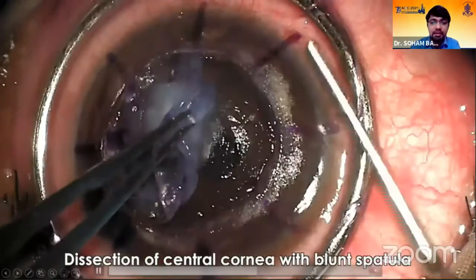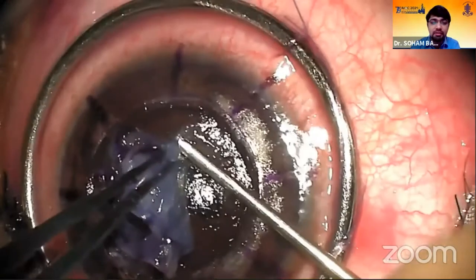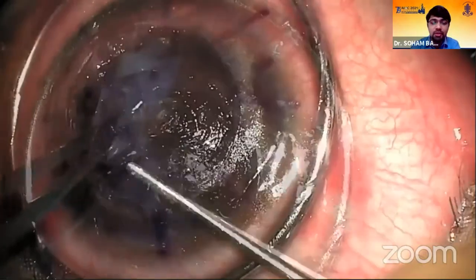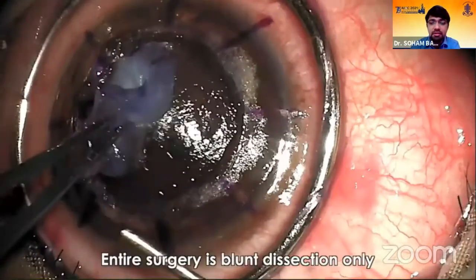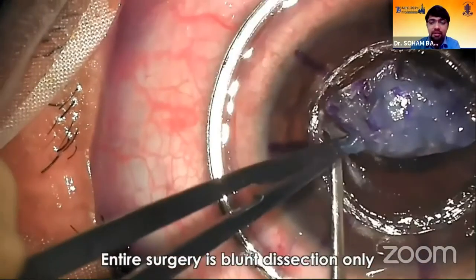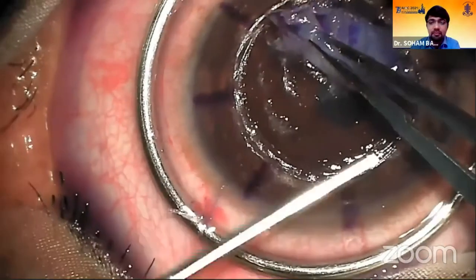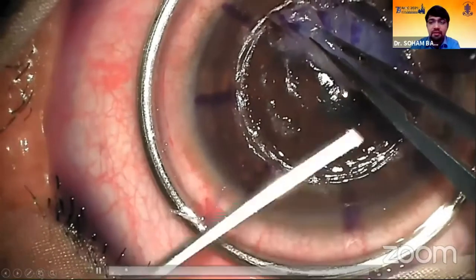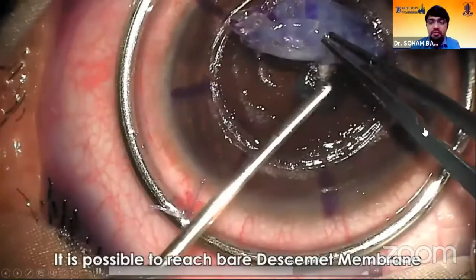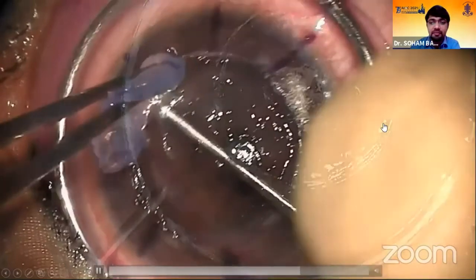And once the groove is complete, it's a matter of stromal separation. This is using an iris spatula. So no sharp instruments to be used in the central cornea. Just lift up the edge. And when you can see the stromal fibers, gently separate them using a blunt dissector like this. And here you can see the shiny reflex of the Descemet's or the pre-Descemet's layer in the central part. So that is a satisfactory endpoint for this surgery.